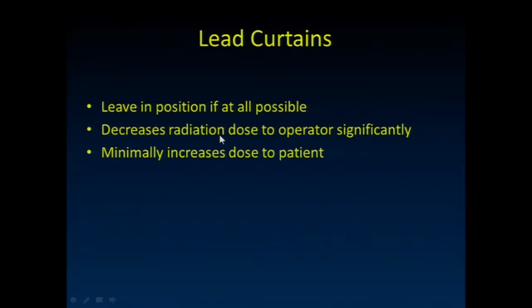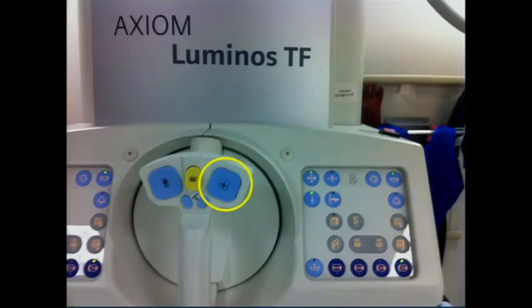Leave those lead curtains in place if at all possible. It significantly decreases the radiation dose to you. Unfortunately, because of backscatter, it does minimally increase the dose to the patient.